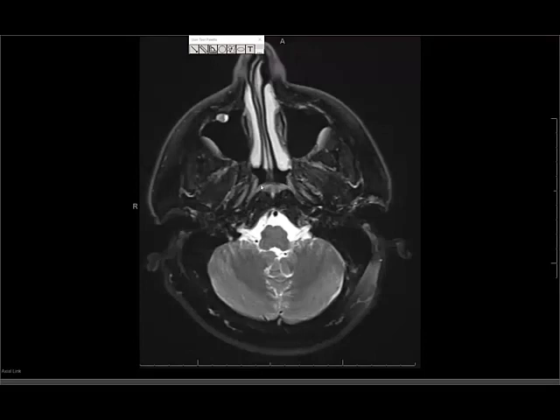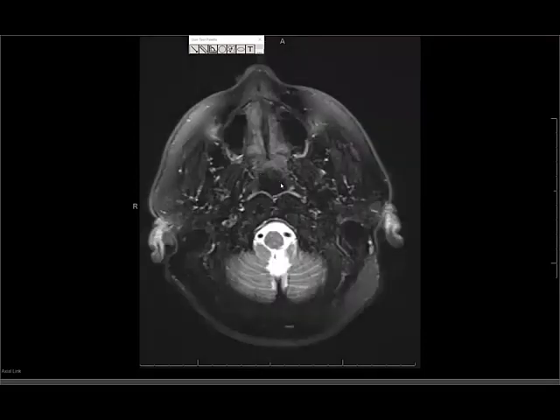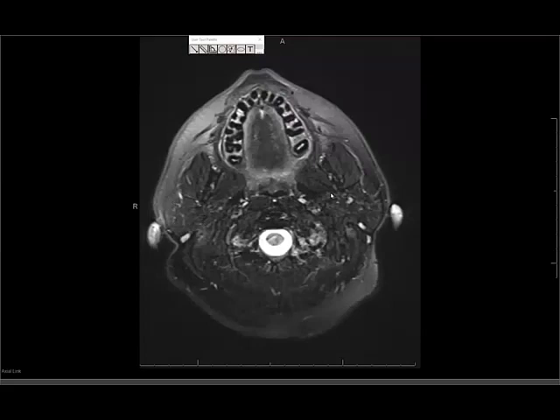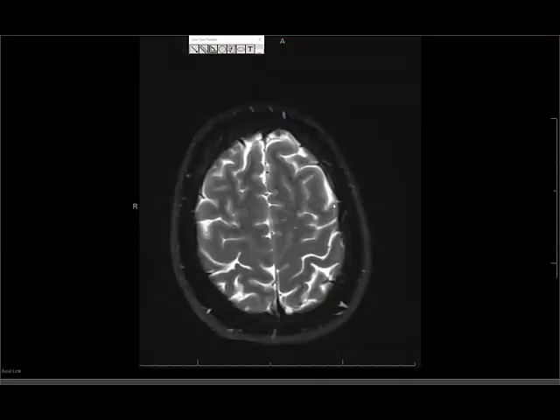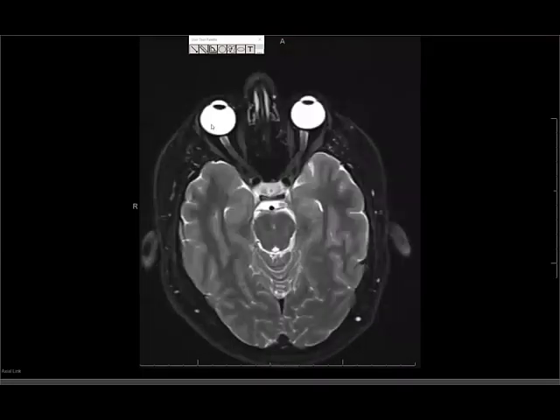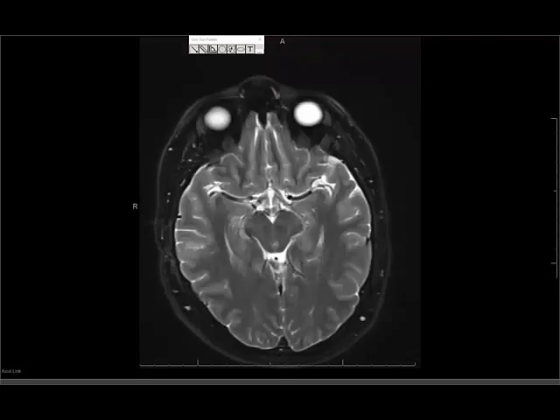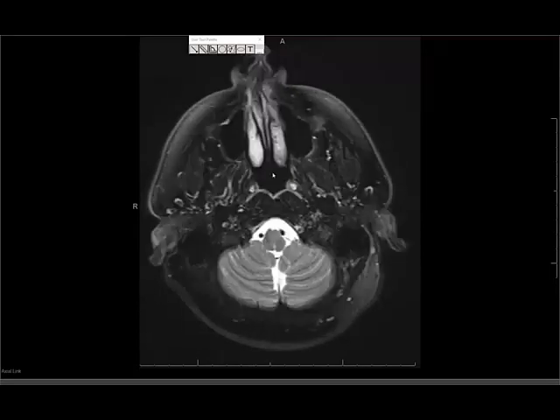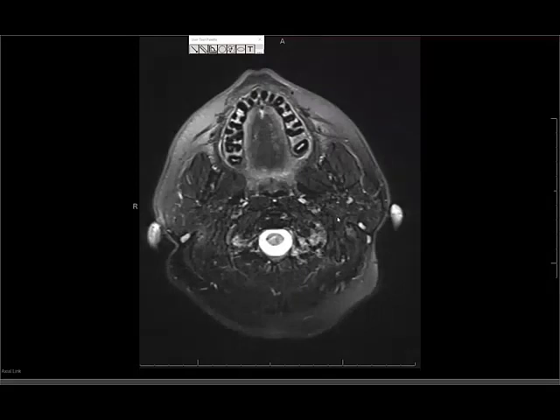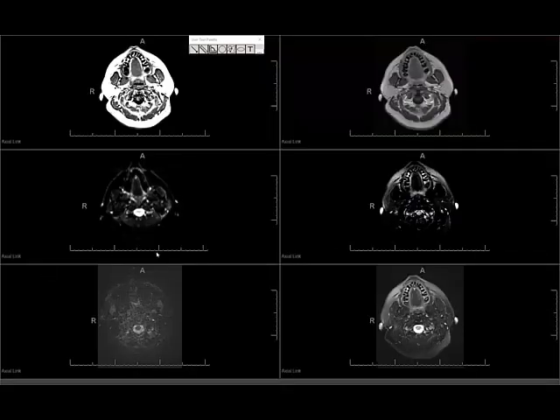Then I look at the nasopharynx to make sure there's no obvious mass, and last but not least, I look at the parotid glands. So to recap, there are at least seven or eight things to look at on the axial T2-weighted sequence: bone marrow, globes, optic nerves, flow voids, IACs, paranasal sinuses, nasopharynx, and the parotid glands. That concludes my simple method of looking at an MRI of the brain. Thank you.